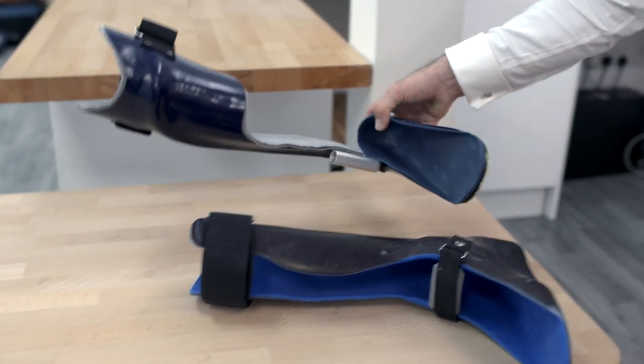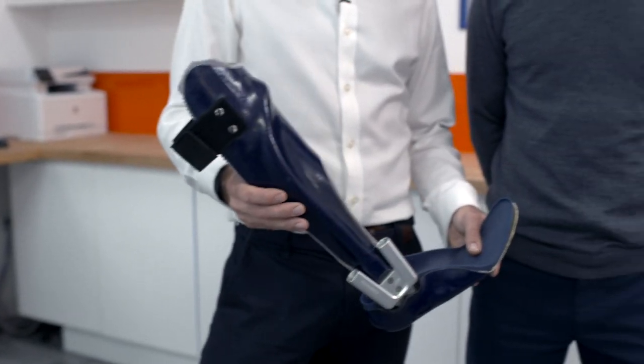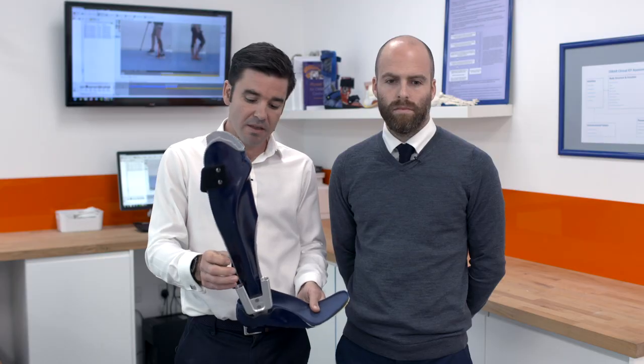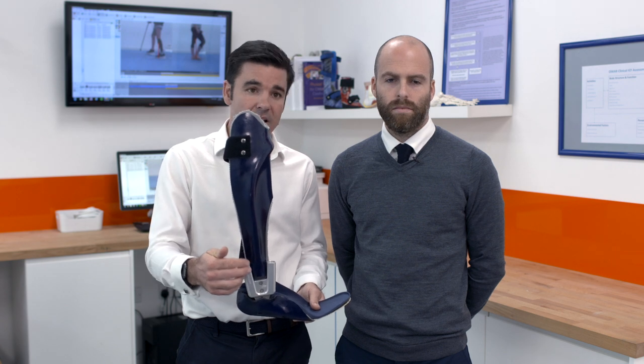Another common prescription that we're using more and more now is something called the Neuroswing. This orthosis is designed with an ankle joint that allows some freedom of movement, and it also enables us to fine-tune the fitting incredibly accurately using the gait lab.